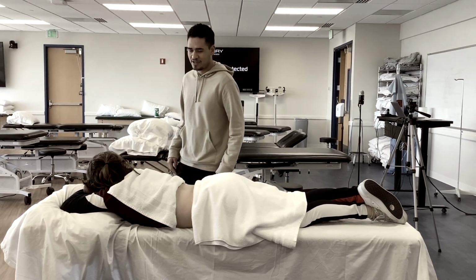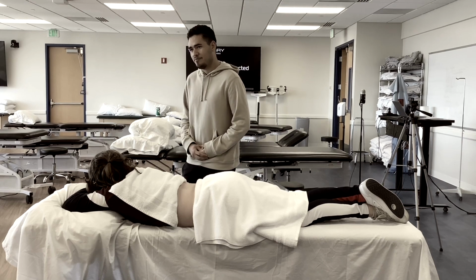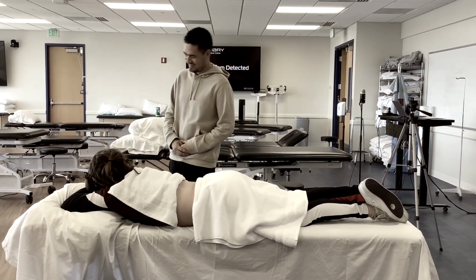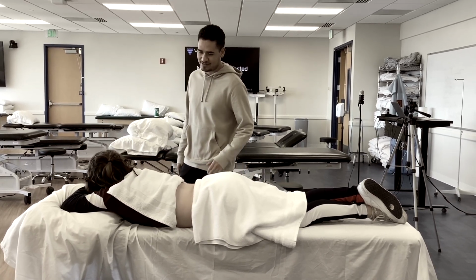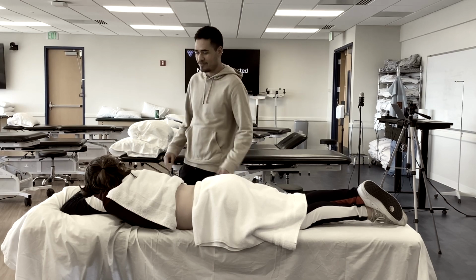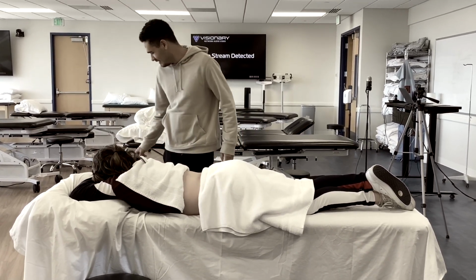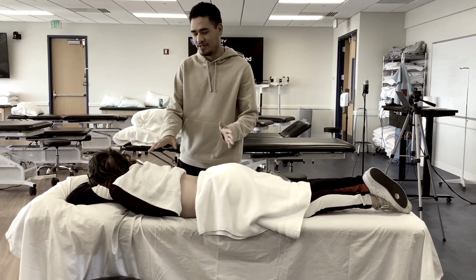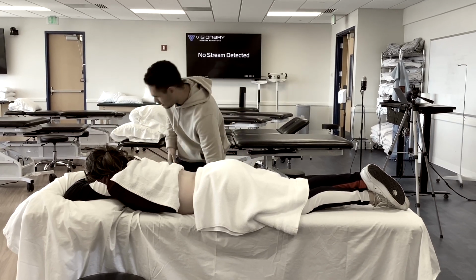Do you have any active cancer that you know about? No. Okay, any pregnancies lately, or any chance you could be pregnant at the moment? I sure hope not. Perfect. And any impaired sensation in that area, you can still feel everything there? Definitely can. Okay, perfect. Just making sure. So then the patient is prepped, and I applied towels just to help her feel comfortable and know what area I'm going to be working on.